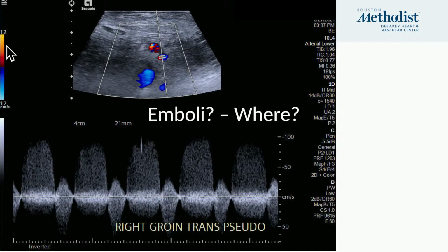Despite Siemens haven't figured out which is positive, negative, don't be bothered that this is positive, but this is coming towards you, this is going away. Hopefully one day they will get a negative signal here. Here's a tiny negative signal, not much on this, so this is assumed positive. This may be the negative one. And this is why it tells you this belongs to the blue signal. This is going away from your probe, so that's why it's going out of your sac.